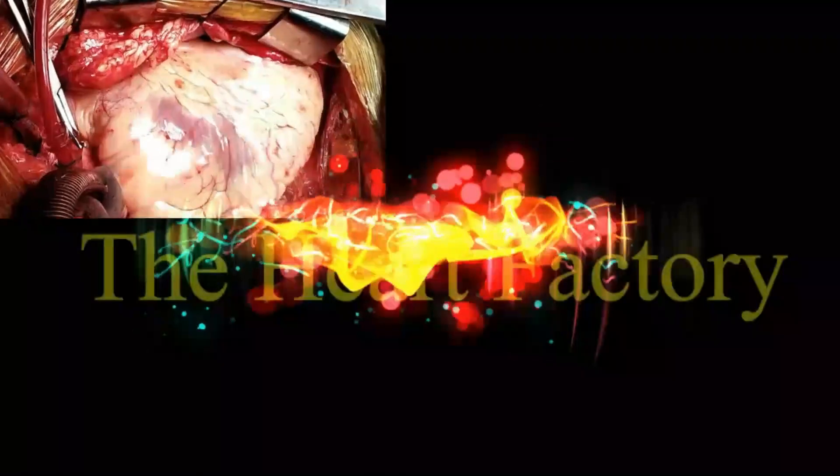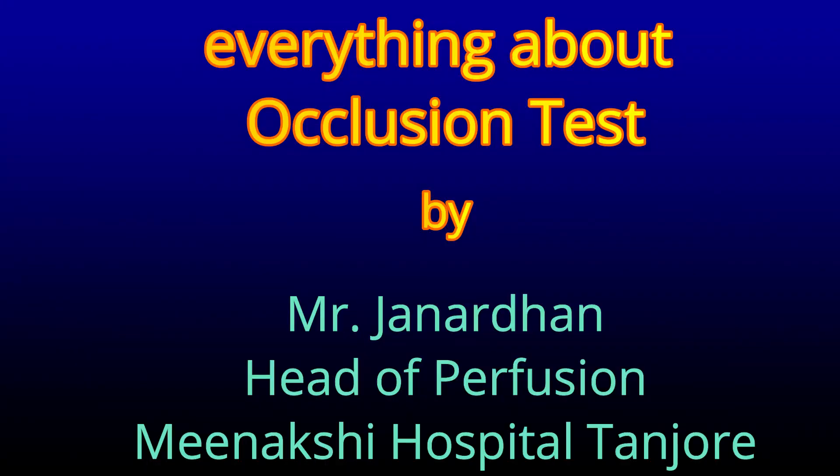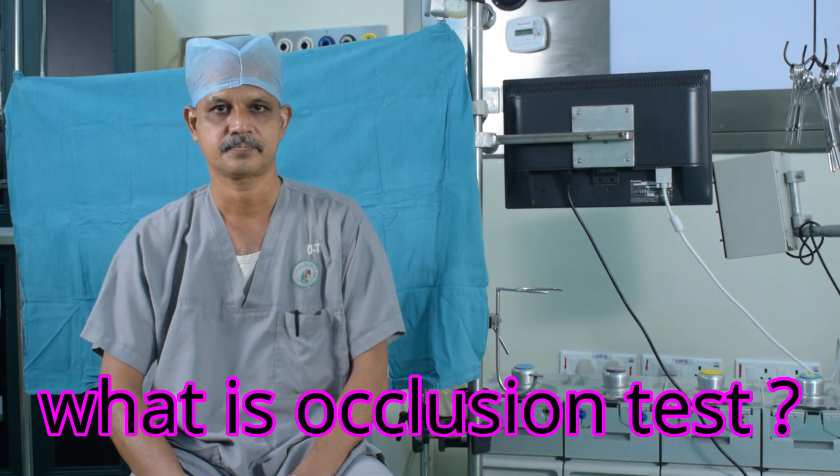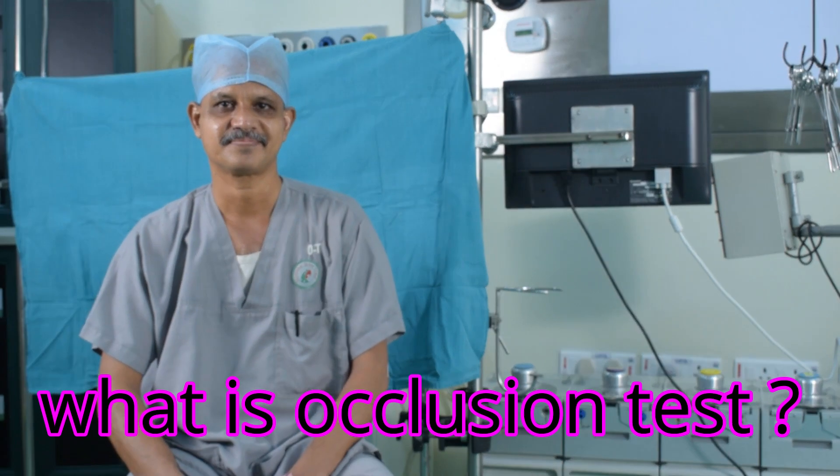Welcome to another video from the Heart Factory. The first question is: what is a occlusion test?